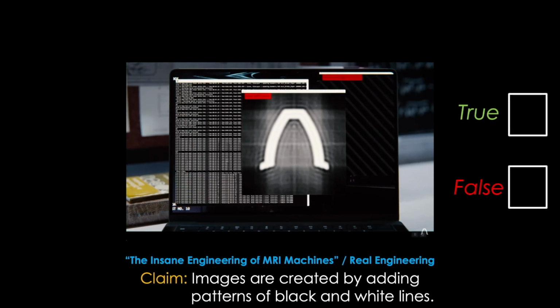Claim. Images are created by adding patterns of black and white lines.